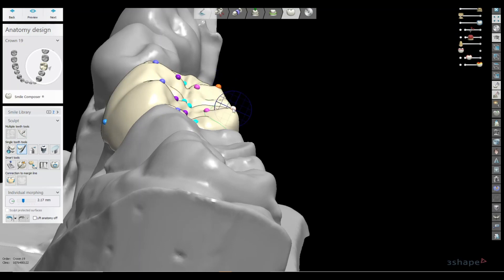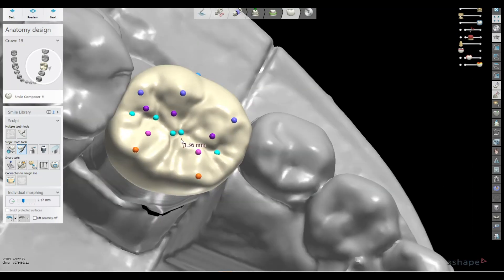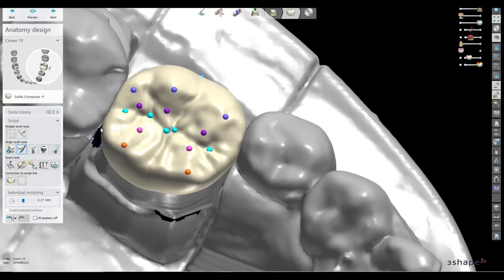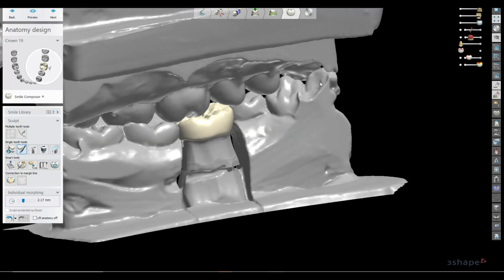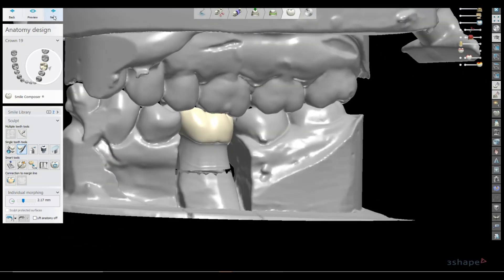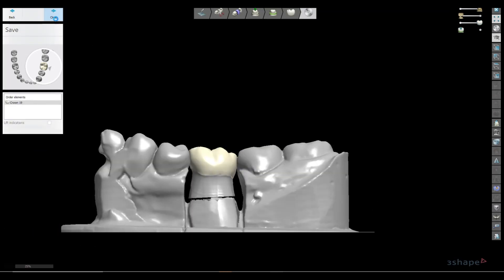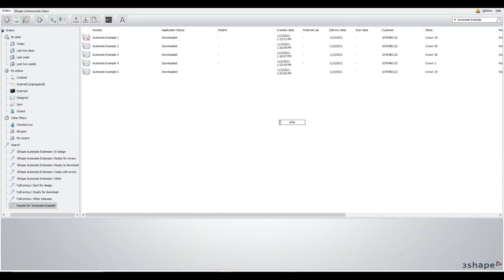If you wanted to make a slight adjustment to a cusp tip or emergence profile, you could do that. Sending and editing with Automate and Dental System 21 is super easy.